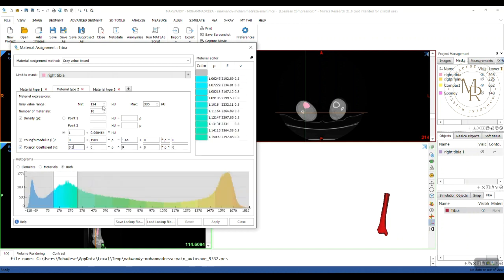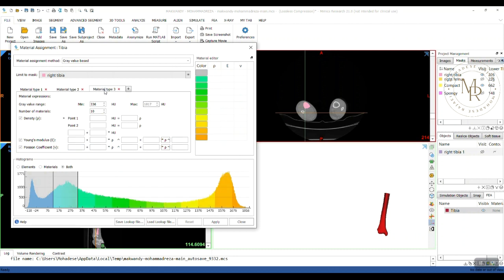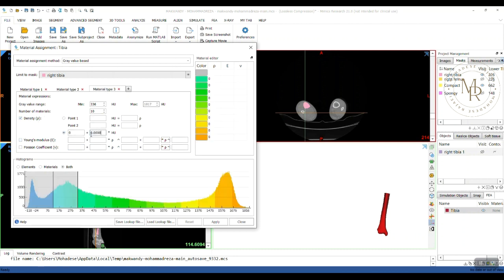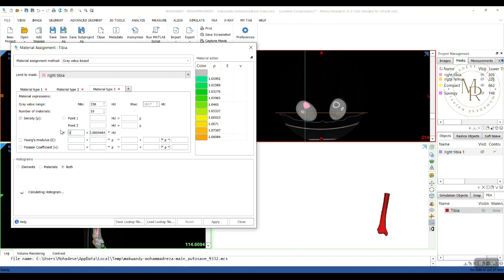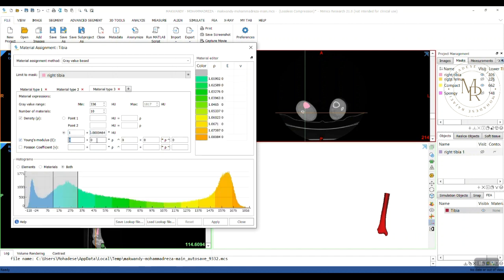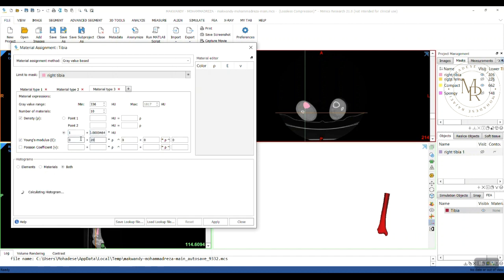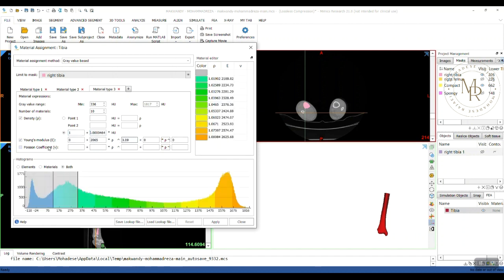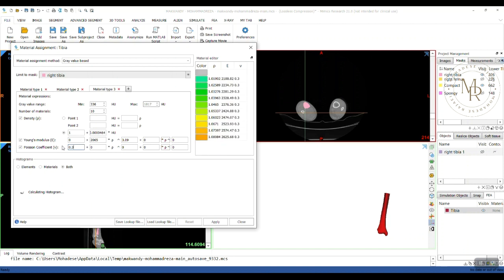Alright, and for the third material, which is cortical or compact bone, the Poisson ratio. And now, hit the Apply button.